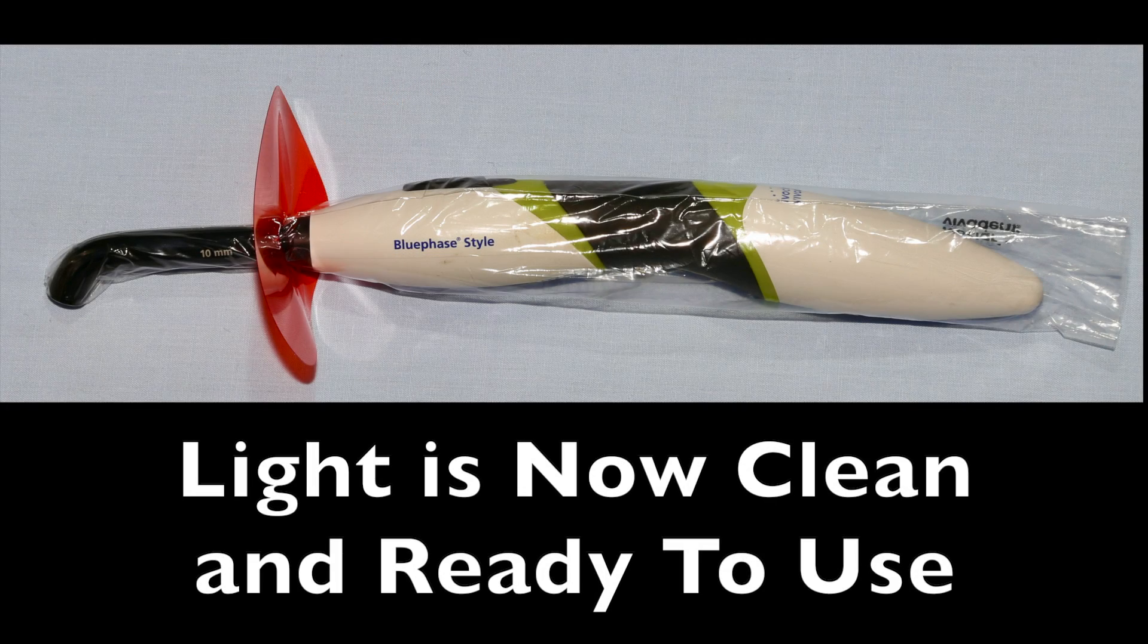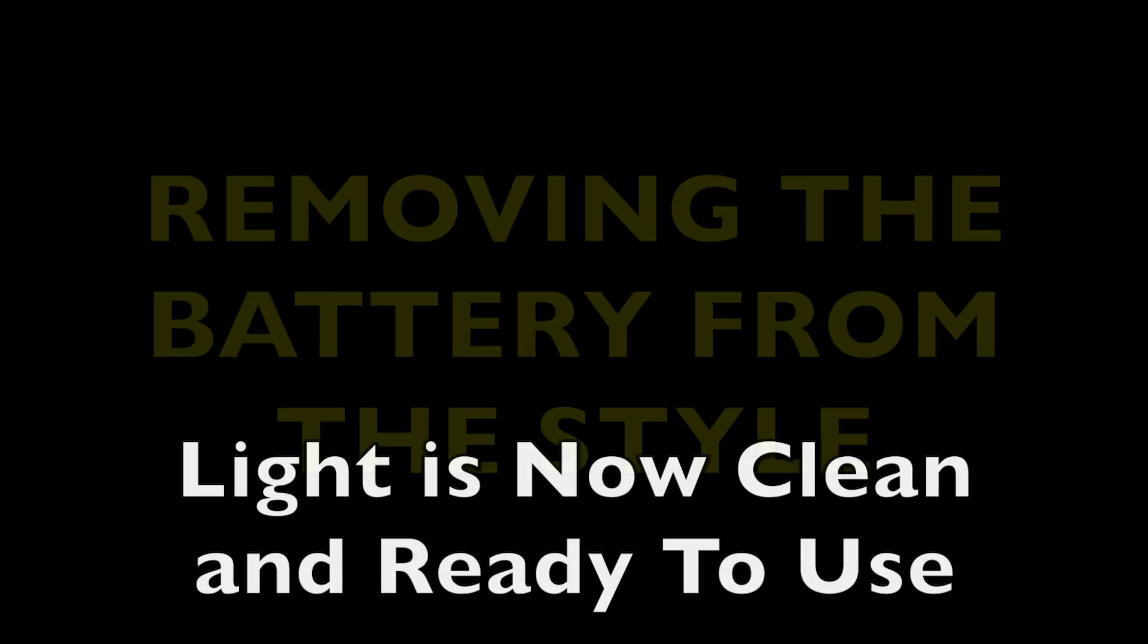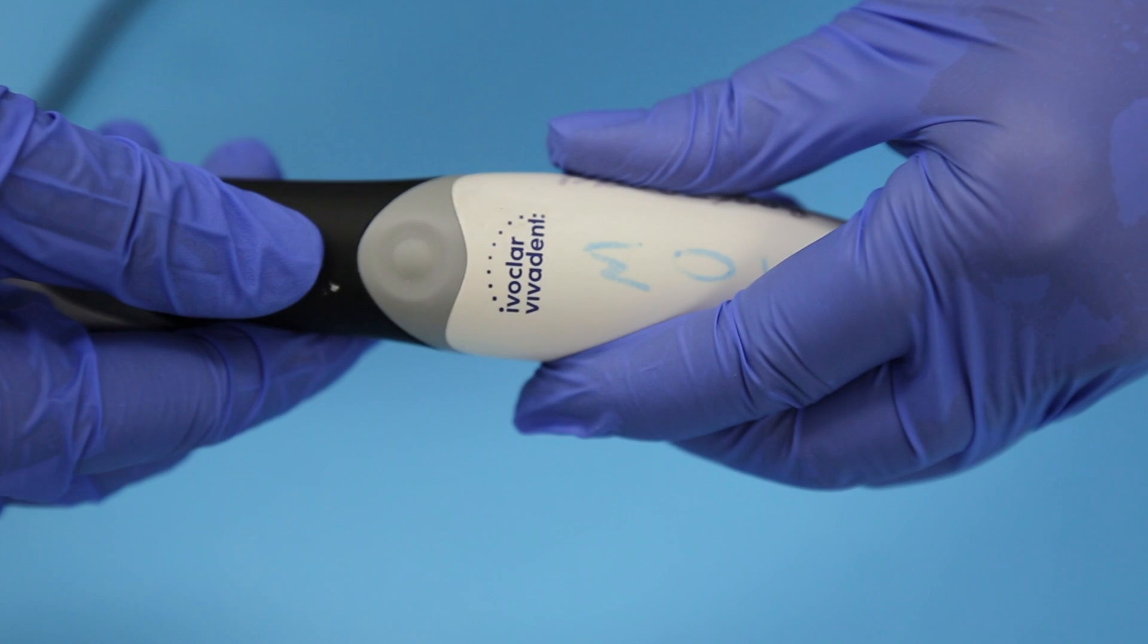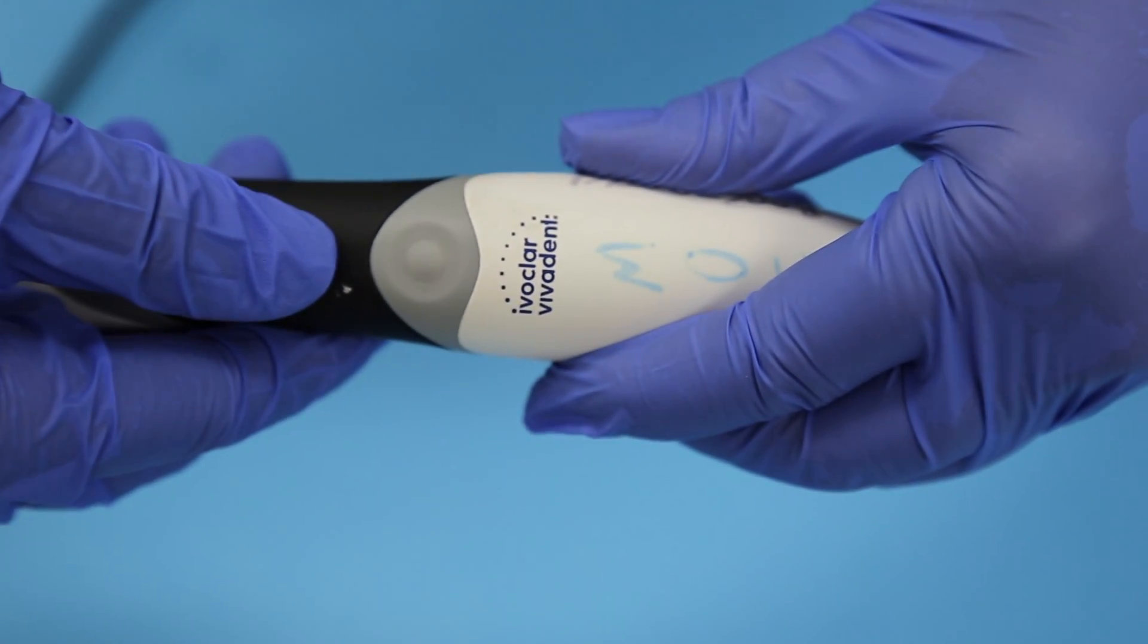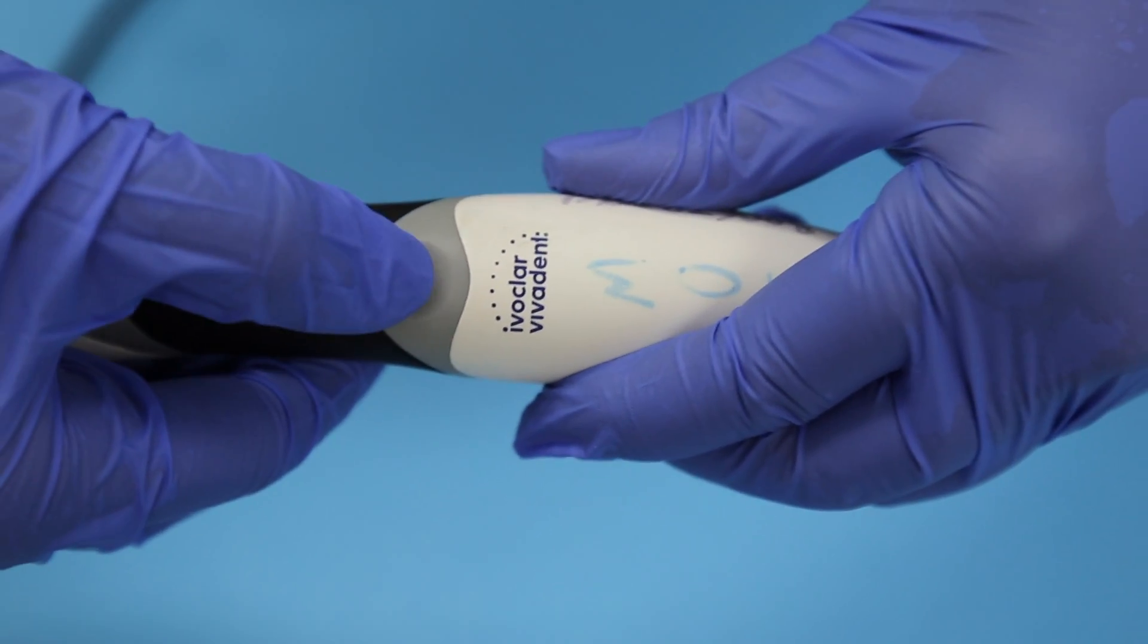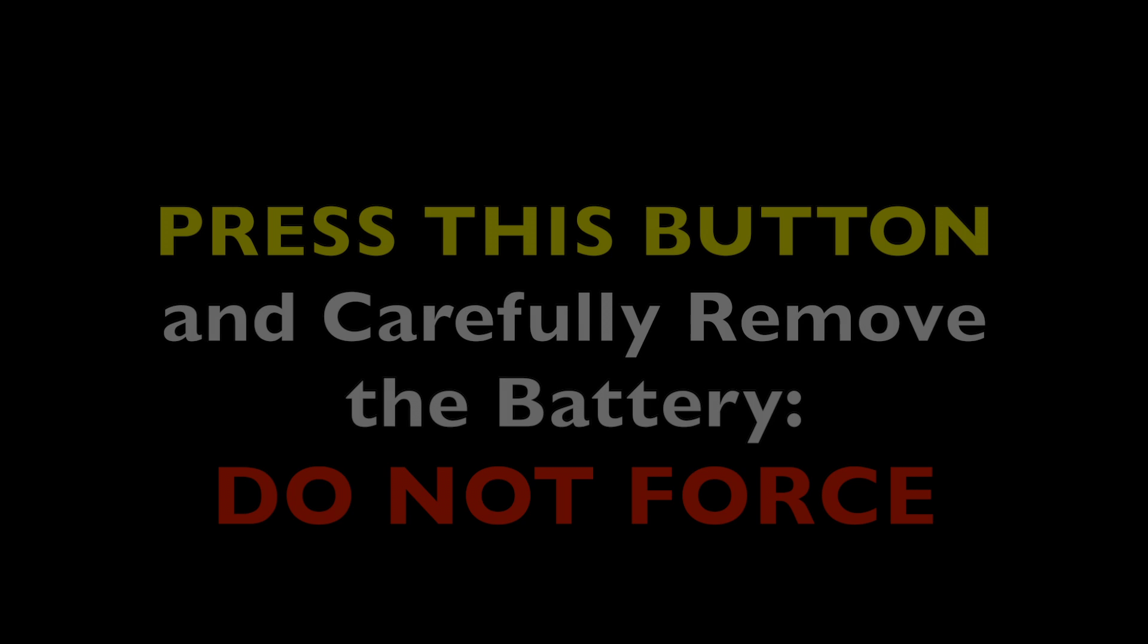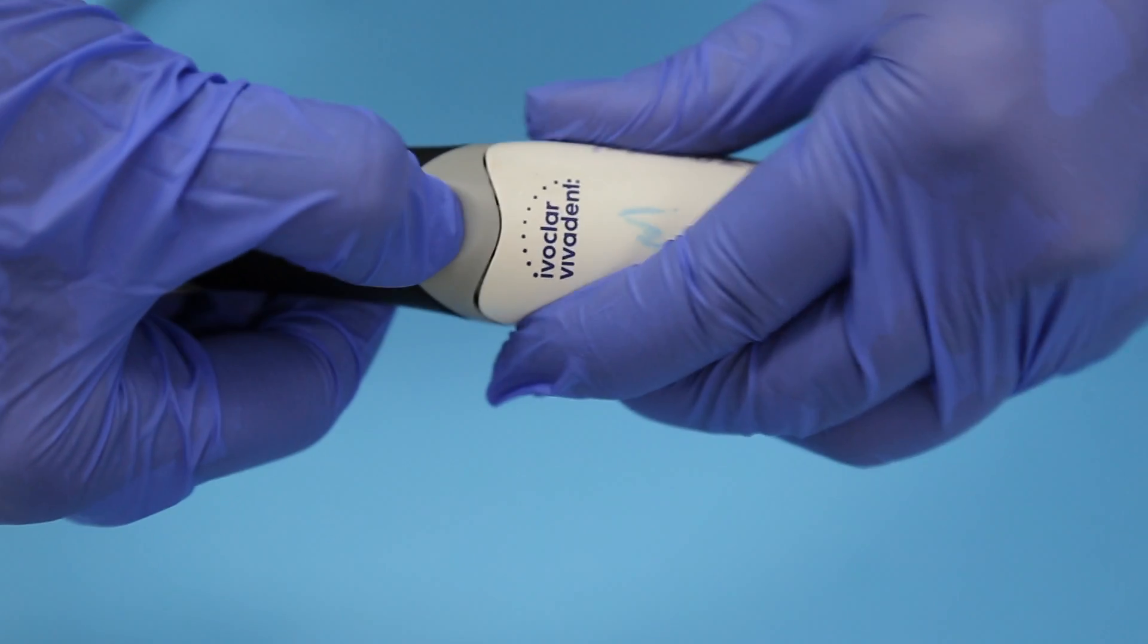So now the light is ready for use. Just some further information on this particular light. If you need to remove the battery, you're going to press this button and then carefully remove the battery. Don't force it. There have been reports of the battery compartment breaking because people have been putting on it too hard.